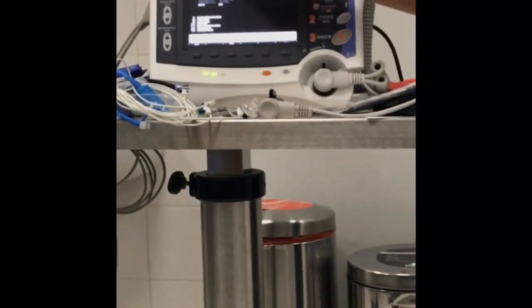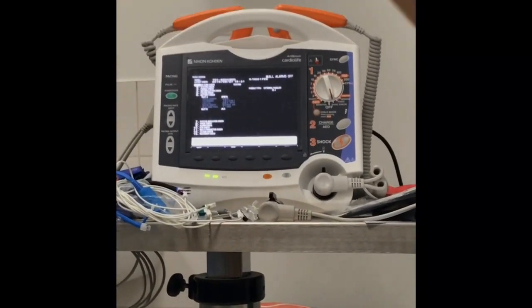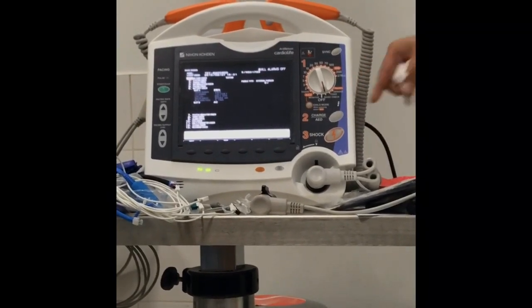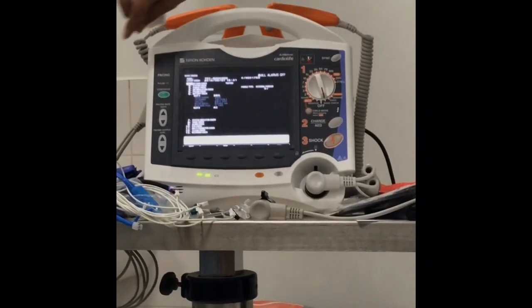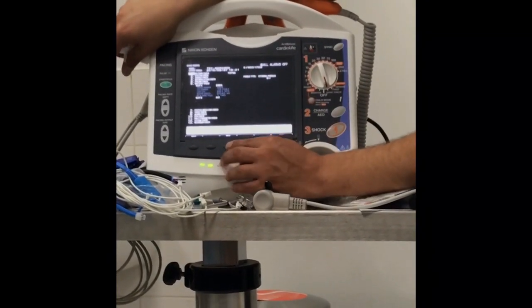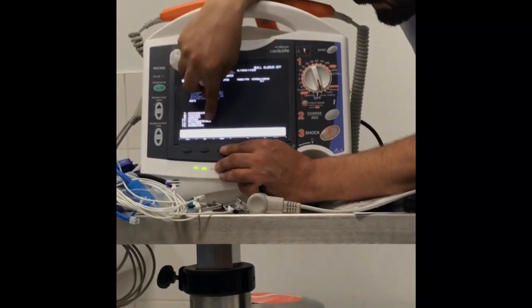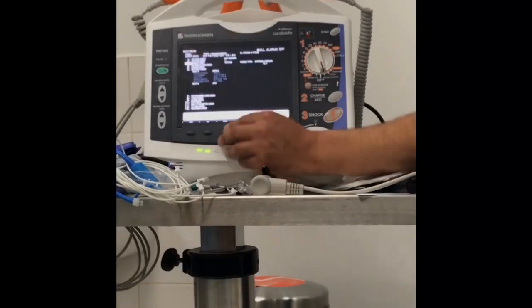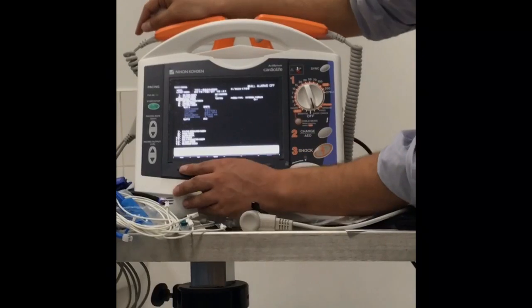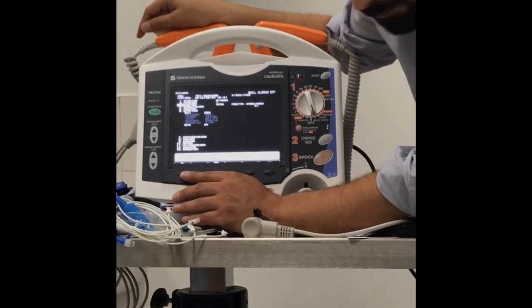Then system check is okay. Detecting external button. Is this correct? Yes, it's detecting because I have light here. So press yes. Then the operational check. Don't disconnect the cable until checking finishes. The machine asked me to press number two, then number three, then again number two.